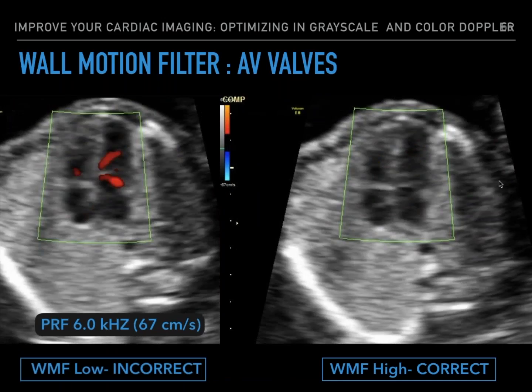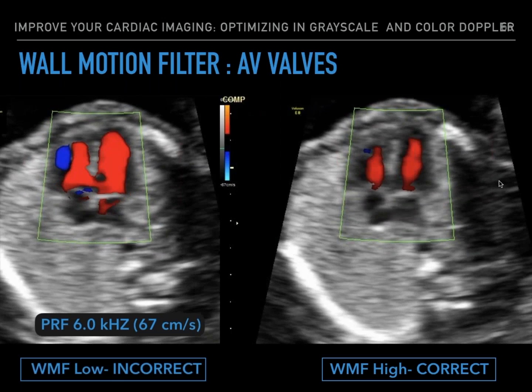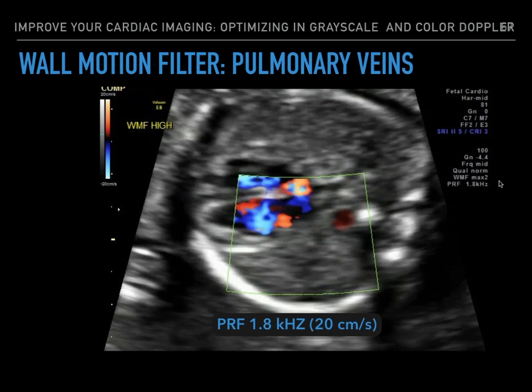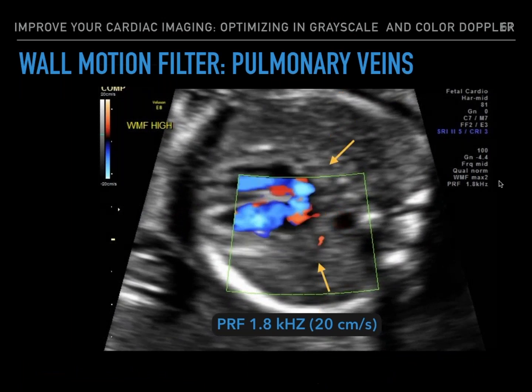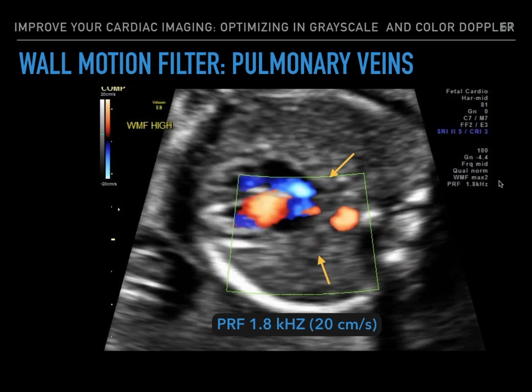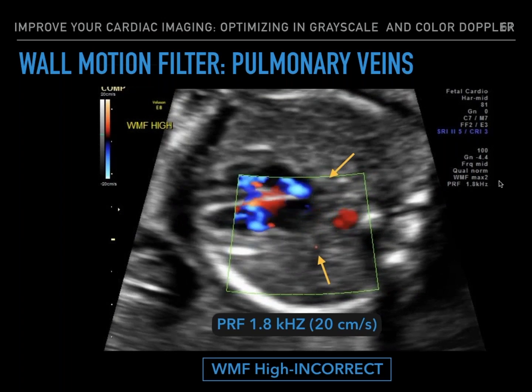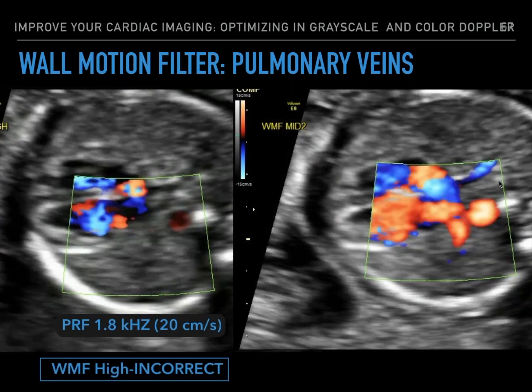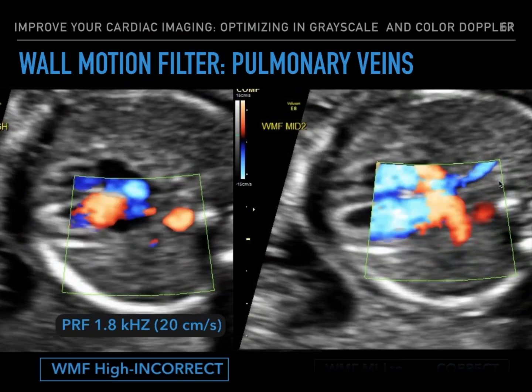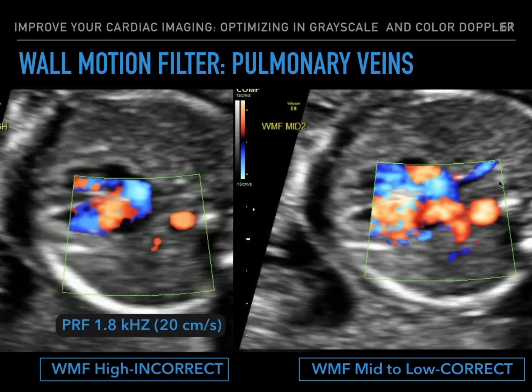And here you can clearly see the difference between the two. Same with the pulmonary veins. Here we have our PRF scale set to low at 1.8 kilohertz, yet we are not seeing the pulmonary veins filling in. This is due to an incorrect wall motion filter set to high. Utilizing a mid to low wall motion filter setting is actually appropriate for evaluating the pulmonary veins. And here you can see the pulmonary veins draining in nicely into the left atrium.